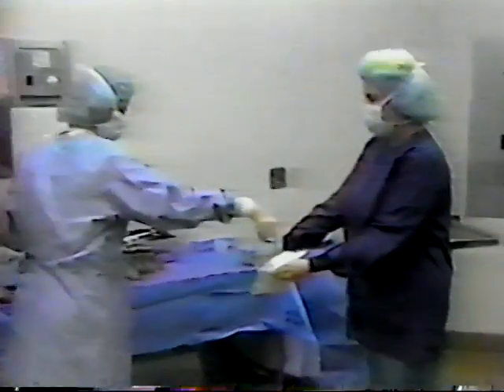In opening peel packs, separate the edges by rolling them back over your hands. The sterile contents can then be offered to the scrub person in a way that minimizes the possibility of touching the unsterile edges.